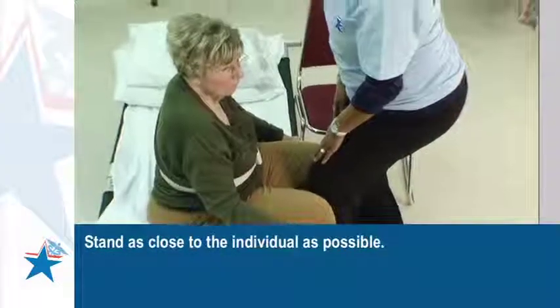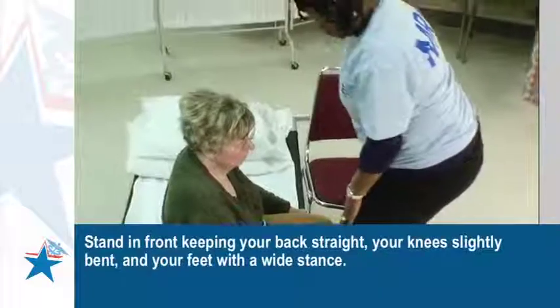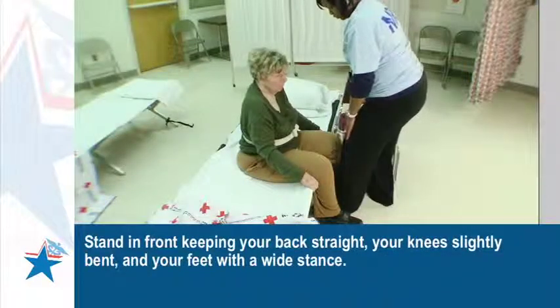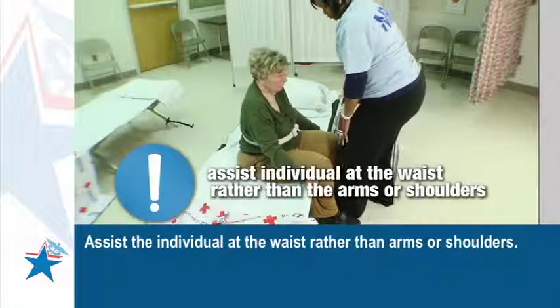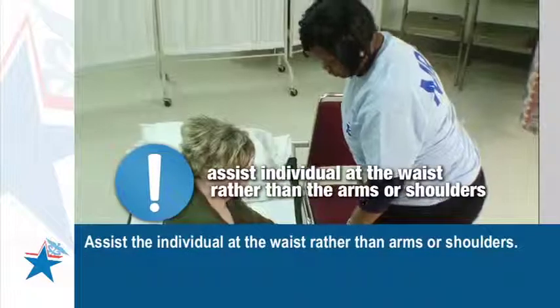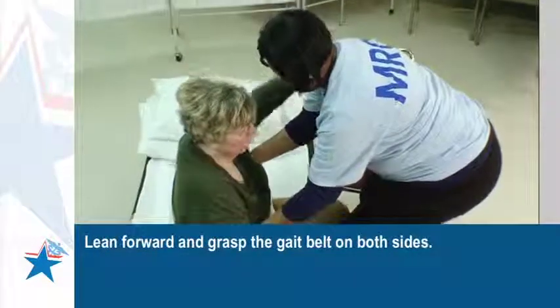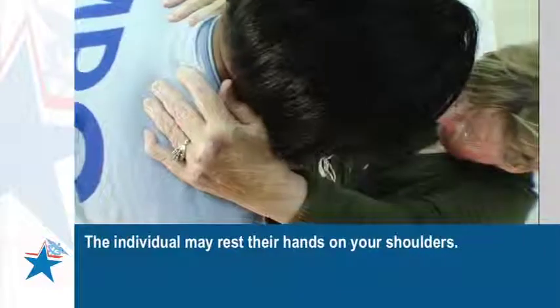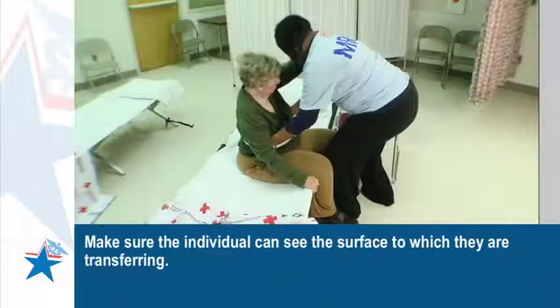Stand as close to the individual as possible. Stand in front, keeping your back straight, your knees slightly bent, and your feet with a wide stance. Assist the individual at the waist rather than the arms or shoulders. Lean forward and grasp the gait belt on both sides. The individual may rest their hands on your shoulders.